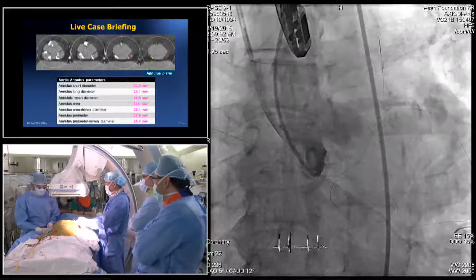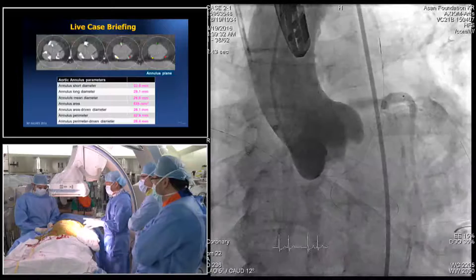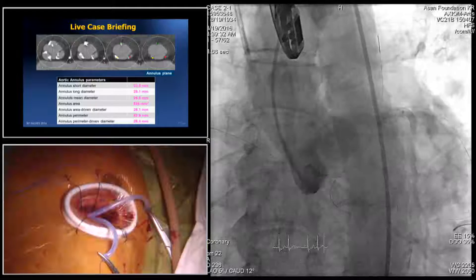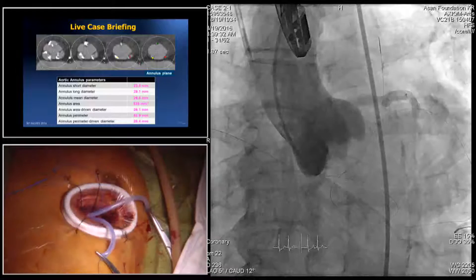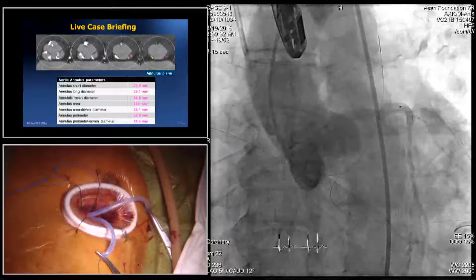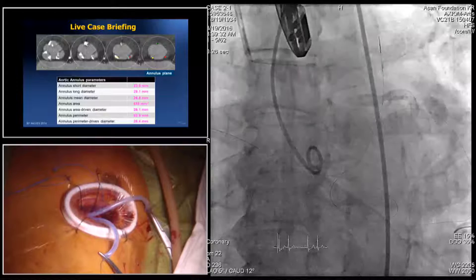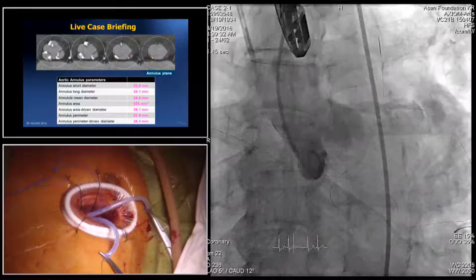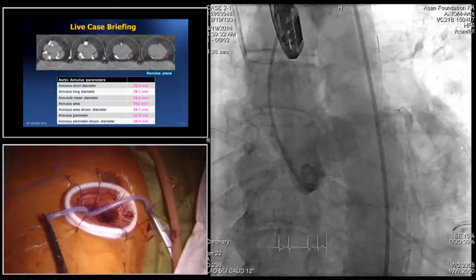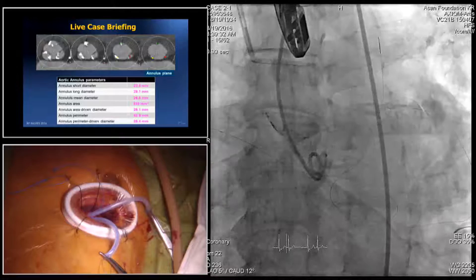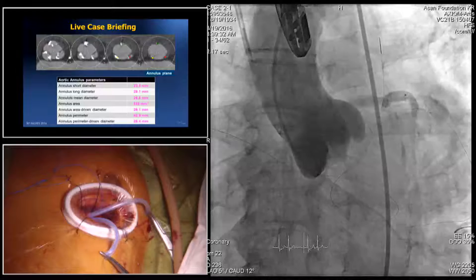We'll start the procedure. The chest is already opened with a small left thoracotomy. I use two large pledgeted U-shaped sutures with a big MH needle — you have to use a big needle for this. If using a purse-string suture, you'd use a regular SH needle. My approach uses two large pledgets, two sutures. Heparin has been given, femoral vein and femoral artery access are established, and the projection angle is determined by CT. We performed an aortogram and it looks good for the projection angle.